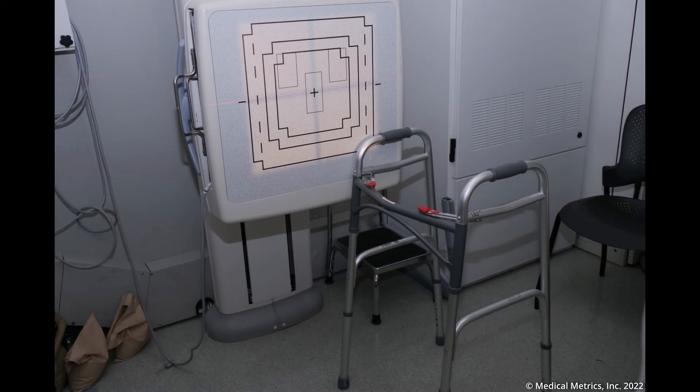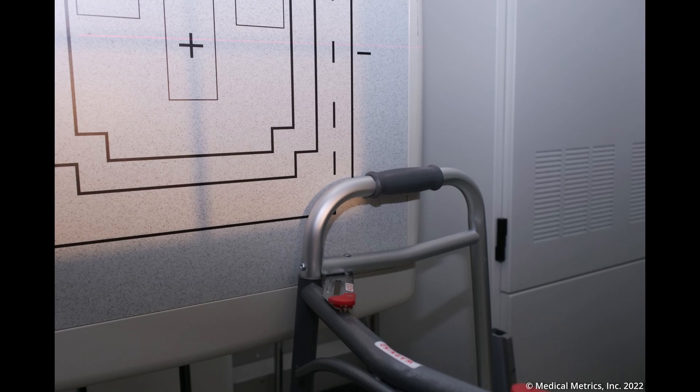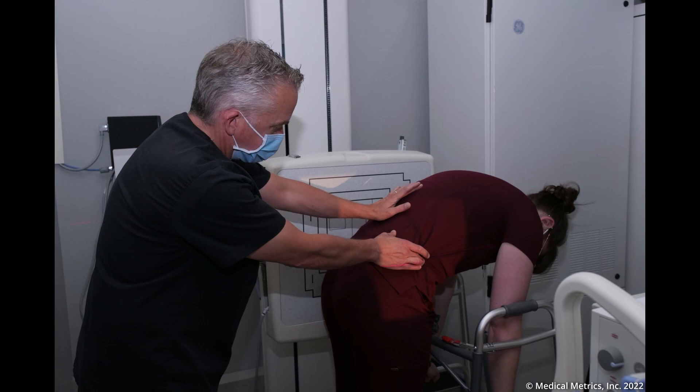Initially position x-ray equipment as for a standing flexion lateral lumbar spine x-ray. Use the exposure settings that are normally used at your facility for lateral lumbar spine x-rays. Place the walker in front of the bucky. If the patient is unusually short or tall, the height of the walker can be adjusted as needed. Position the patient for the flexion x-ray with their left side against the bucky and their thighs touching the front bar of the walker. This is important since it helps minimize bending at the hip joint and encourages flexion across the lumbar spine.